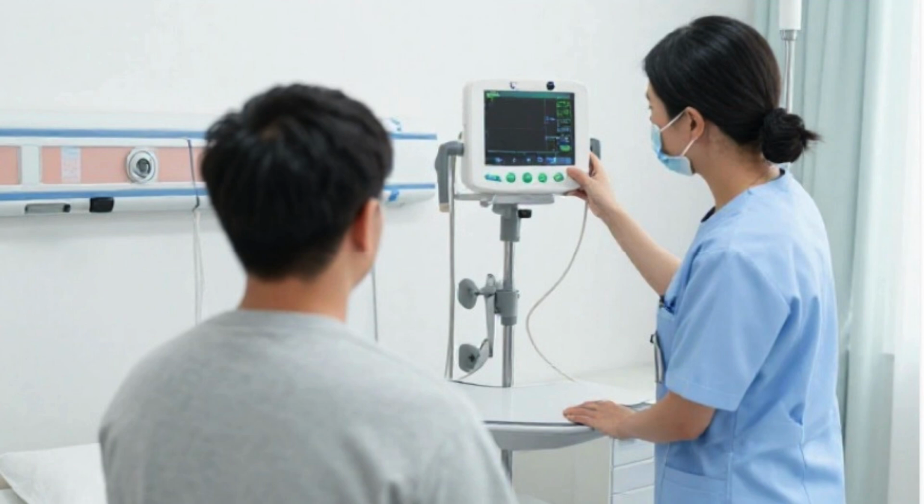In addition, patient monitoring systems must be reliable during power interruptions. For this reason, most monitors are equipped with internal batteries that allow continued operation for a limited time. Technicians must regularly check battery condition and replacement schedules.